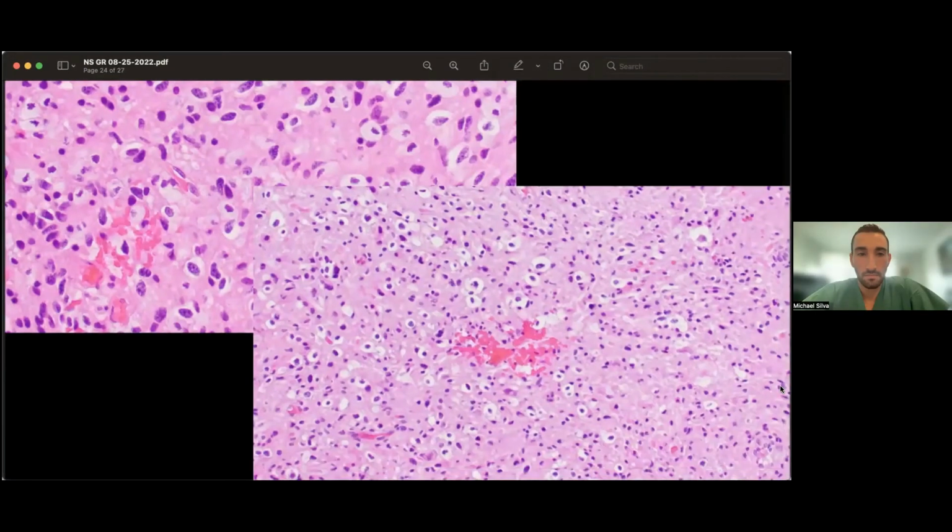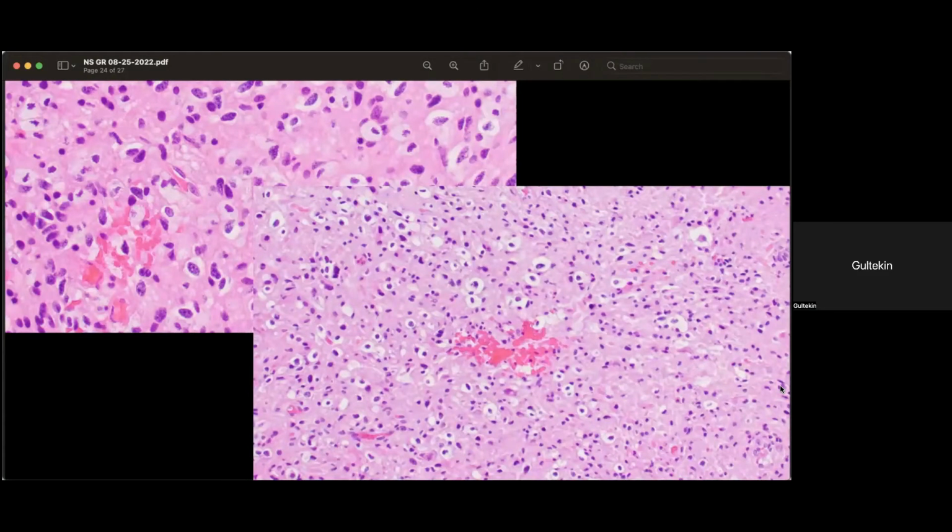And next slide. There are also other parts of the tumor where there's a halo around the individual tumor cells. These are not all macrophages or oligodendroglial cells. There are a couple of macrophages here and there on the left picture at the top, of unknown significance.